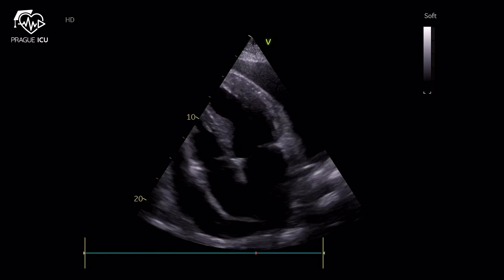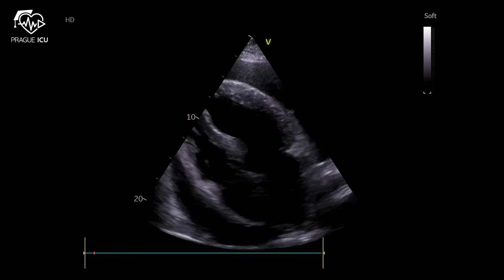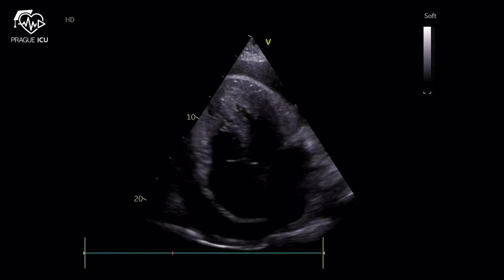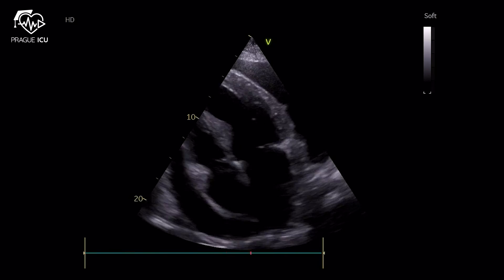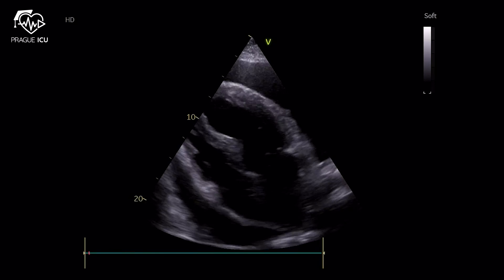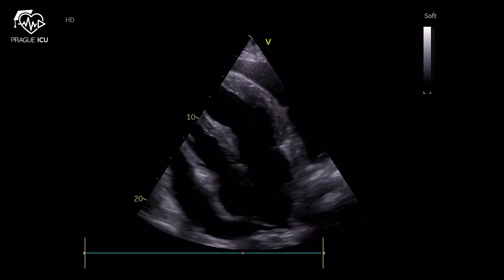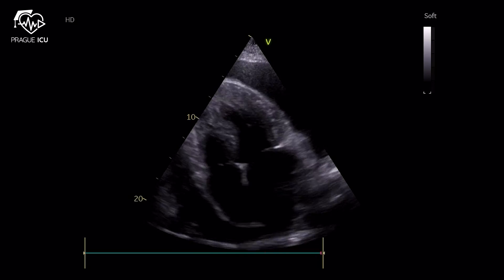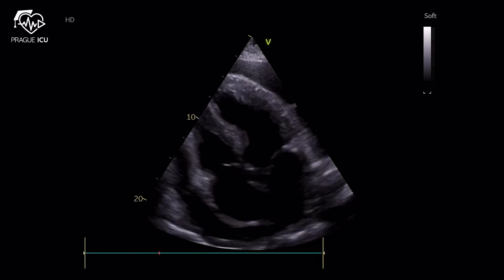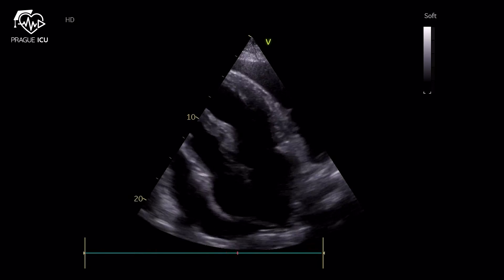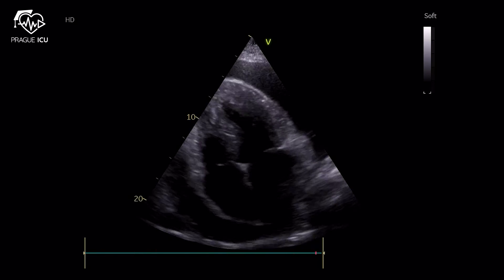As the first step, we need to confirm the size and location of the fluid in the pericardium. In this patient, we can appreciate the large circumferential pericardial effusion.